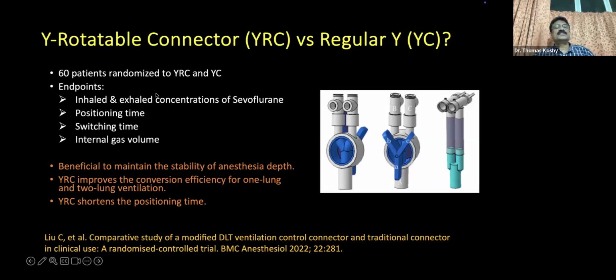They studied 60 patients randomized to the Y rotatable connector and the regular Y connector. What they found was that it is beneficial to maintain the stability of anesthetic depth, because when you clamp, unclamp and release, anesthetic depth comes down, and this Y rotatable connector shortens the positioning time.